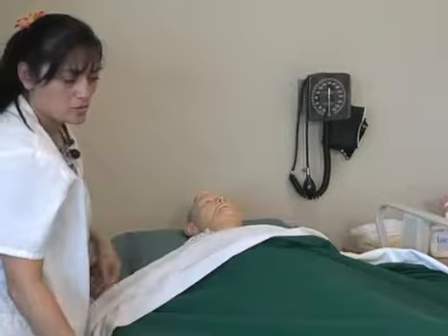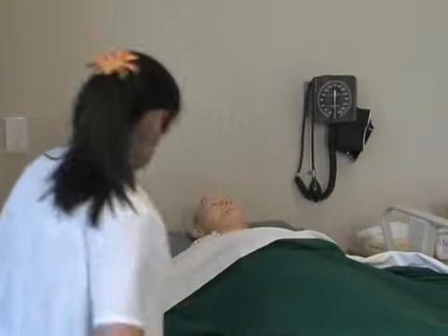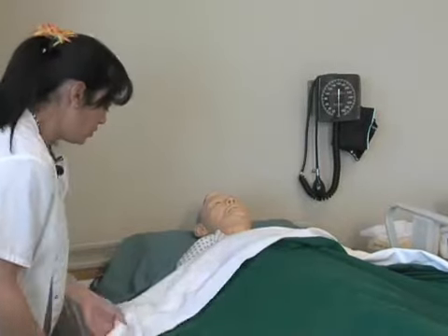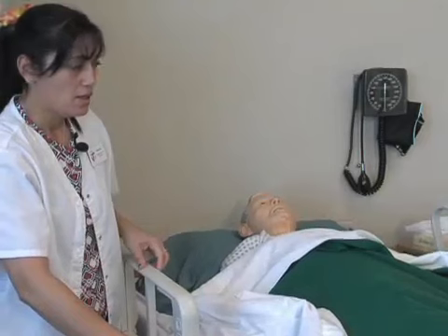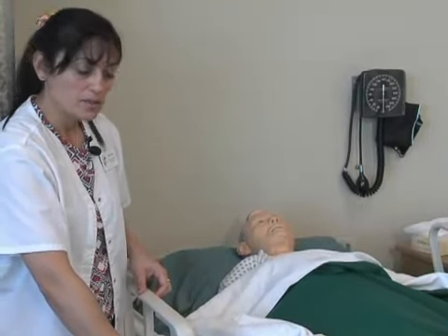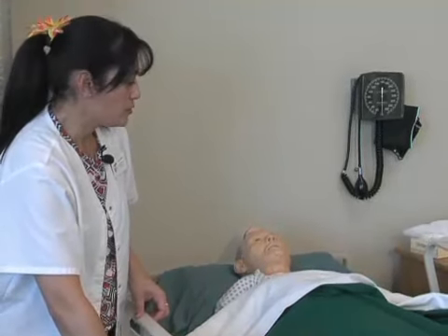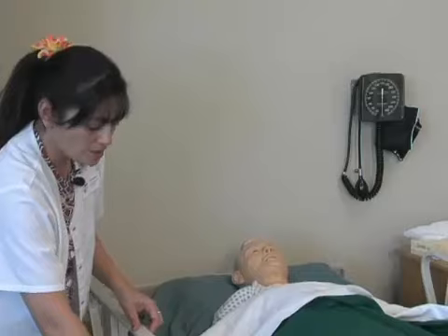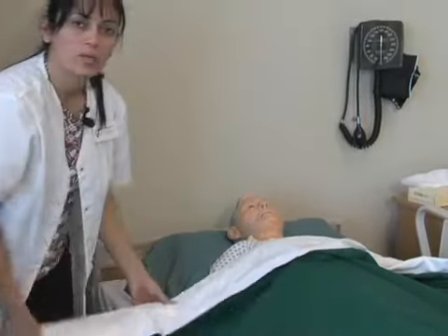I'll make sure to leave the call light, water, and phone with my patient, and then do a safety check and open the curtains. Then I will gather my equipment and wash my hands. I'll let the visitors know that they can come back, and then I will also record and document my procedure.